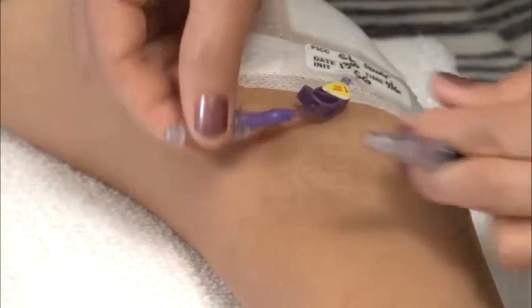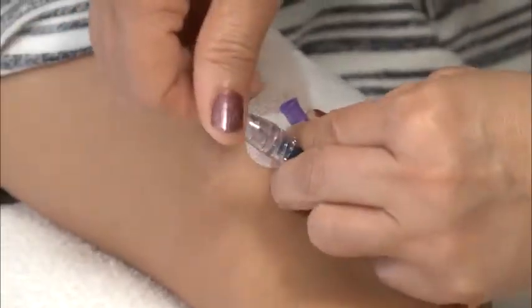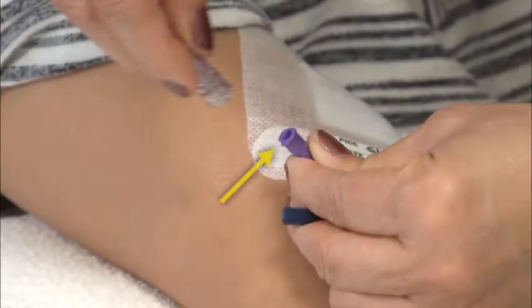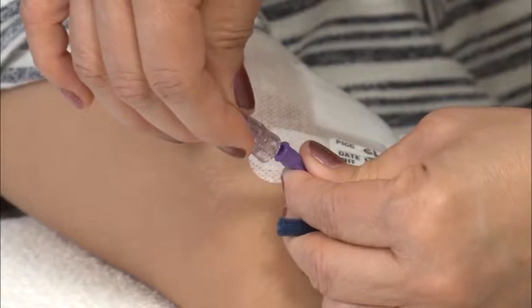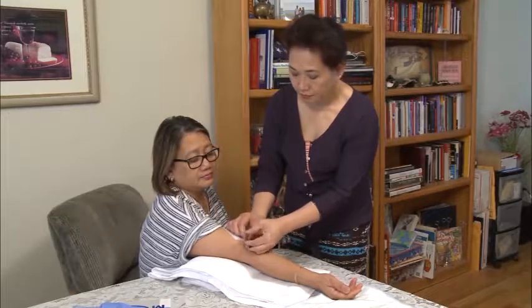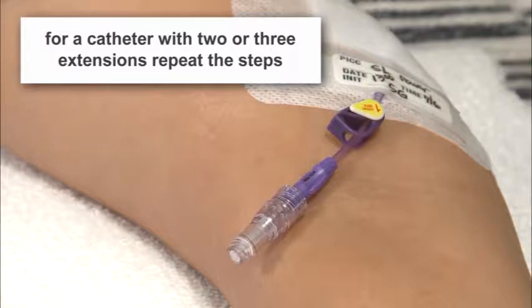Pick up the end of the CVC extension tubing. Remove the old cap. Lift the new connector cap from the protector. Be careful not to touch the open ends of the CVC or new cap. They must remain sterile. Insert into the end of the catheter extension. Twist the cap securely. When this is finished, open the clamp. If you have a catheter with 2 or 3 extensions, repeat the steps for those caps.